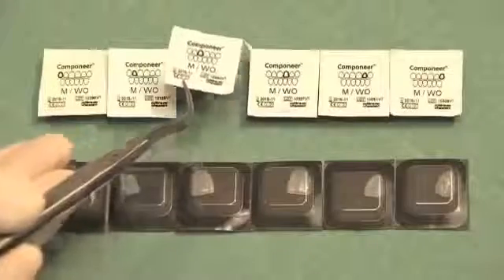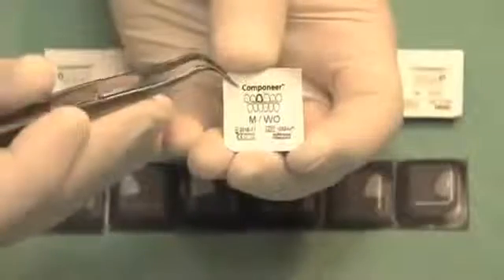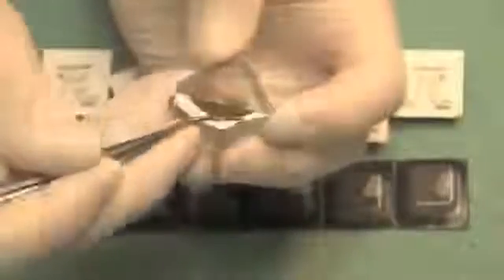The COMPONEERs are individually packaged. The sheet on the reverse side serves for patient documentation. The COMPONEER is removed with a pair of tweezers.